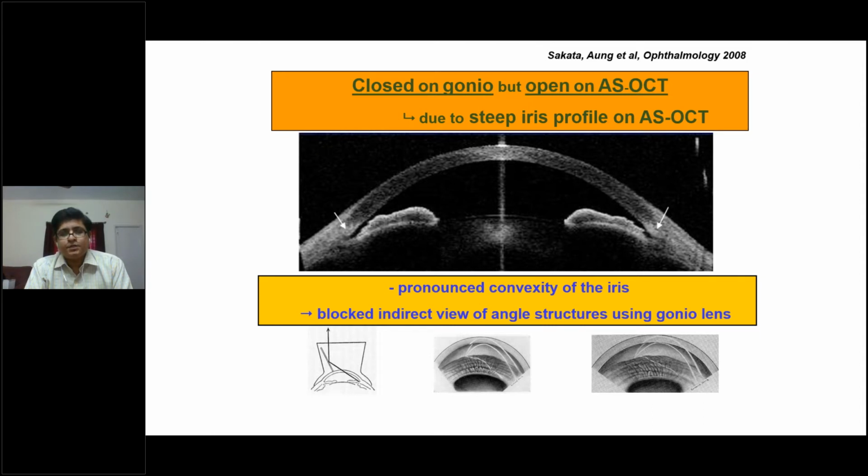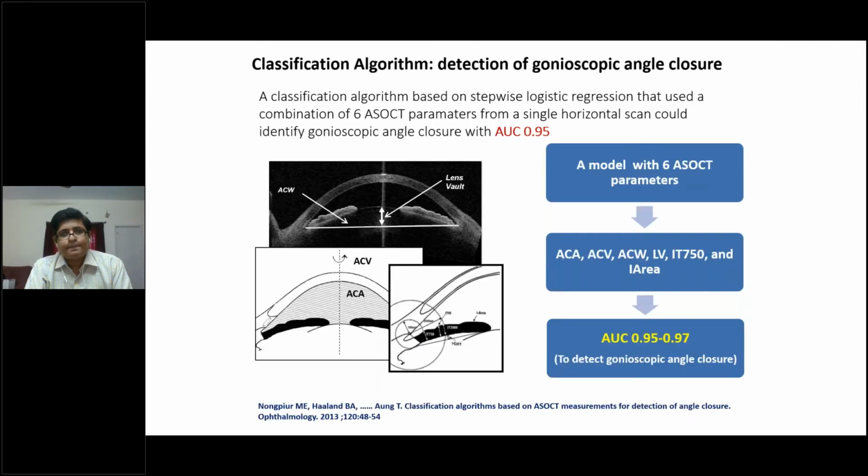So it is worthwhile that, without doing a laser treatment, these patients can be followed up and treated subsequently. And that's what the recent RCTs from both China and Singapore, in which I was involved, tell us: that asymptomatic narrow angles we can follow up without laser PI. However, we have to be cautious in certain age groups and in complete closed angles.